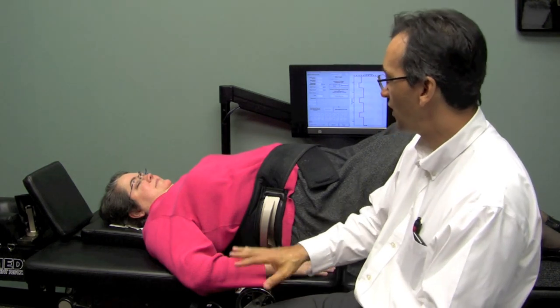They should probably bring their CPAP machine with them. In any case, that's the way it works for the low back. In just a moment I'm going to have Marianne set up on the neck, and you'll get a chance to see what it looks like when somebody's getting a neck treatment with spinal decompression. Thanks.